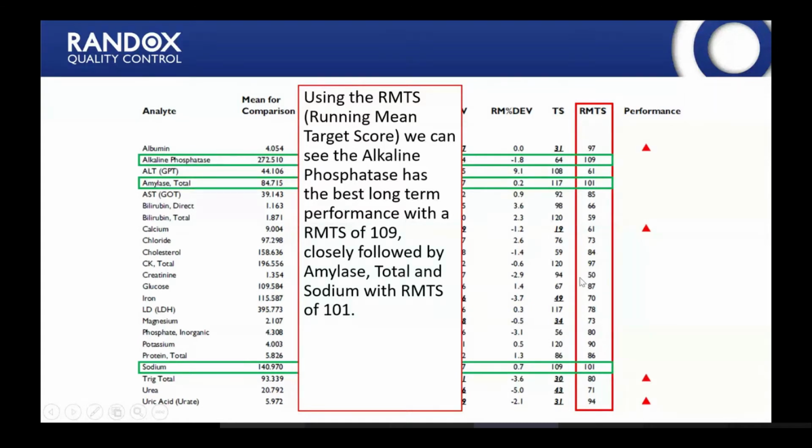So that's maybe an analyte that they're going to want to keep an eye on. So the performance has been okay for this particular sample. So maybe they had an issue in the past that they've now resolved. So they need to just keep monitoring this and make sure that this value keeps going up to monitor their long-term performances.